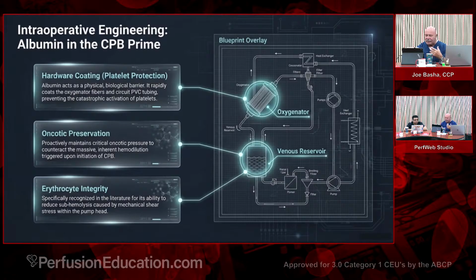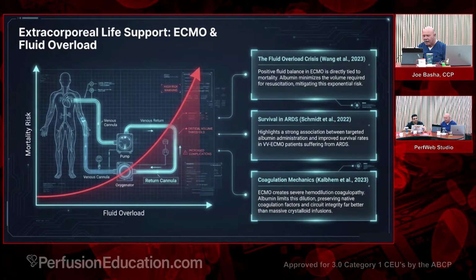So you're reducing the mechanical shear forces by having this protein versus just red cells floating around in saline. Also, it will help you with your complement activation to some degree. No question, not a lot, but a little. Nothing stops the complement.